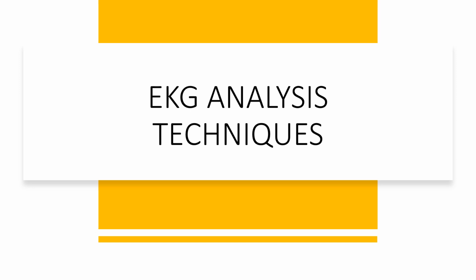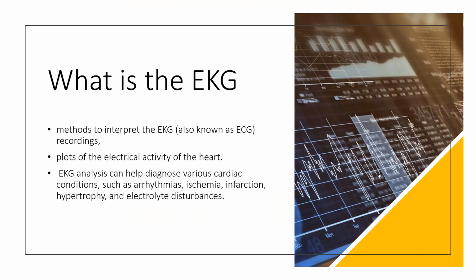We will speak about EKG analysis techniques which are used in our case of study that we worked with. Before we dive into the case of study, we'll speak about what the EKG is. EKG, also known as ECG, is a method to interpret recordings. It plots the electrical activity of the heart.